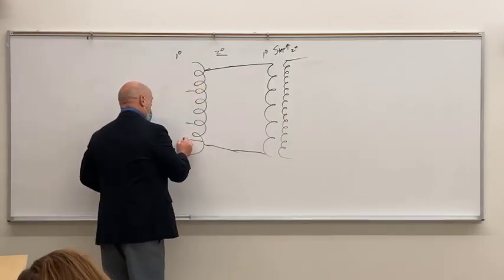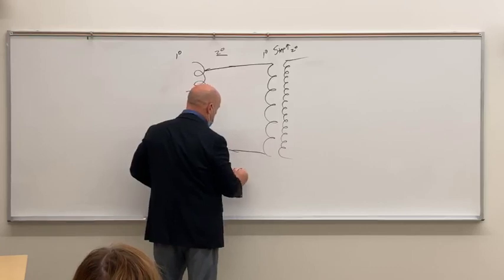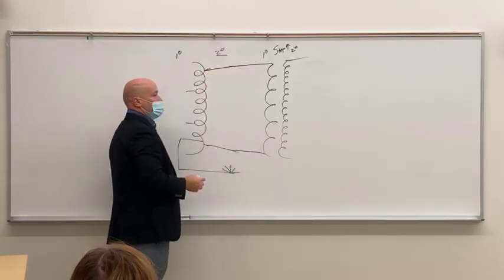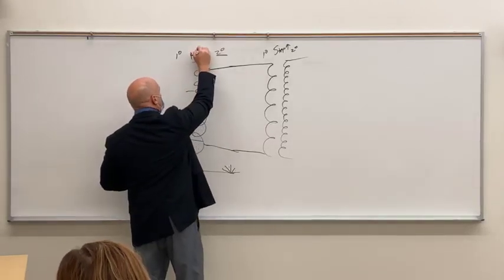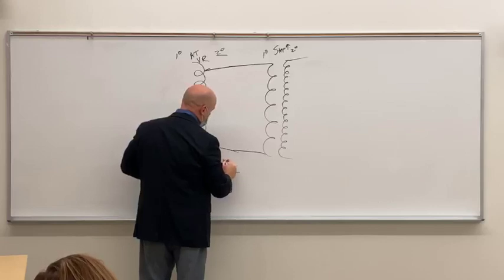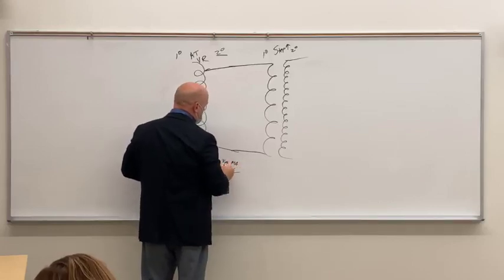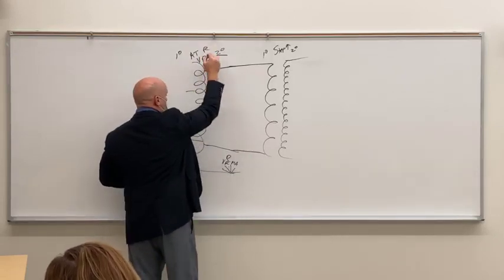At the same time, we've got a secondary circuit that comes off, and we'll call this thing and this thing a rheostat, exactly. In this case, it was an auto transformer, a variable resistor. This is also a variable resistor, but it's an MA selector, and they are both rheostats, right?